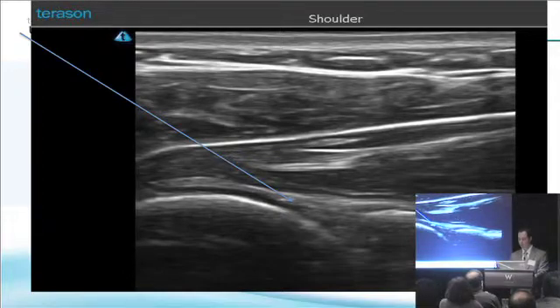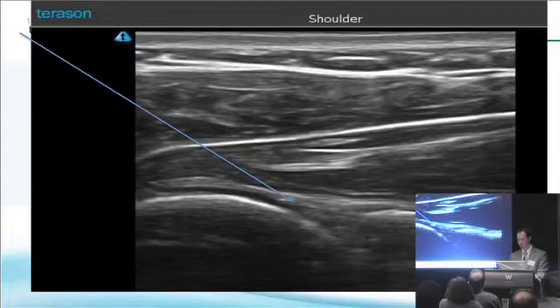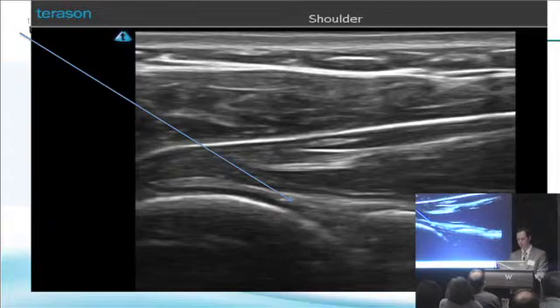At the shoulder, at the posterior joint line — this is the humeral head, here's the glenoid. This isoechoic structure right here is the labrum, and the hyperechoic structure going over the top is the capsule. So your needle tip, if you're achieving a posterior approach to the shoulder, needs to be below the capsule and not in the labrum, and should be right there, coming from lateral to medial.